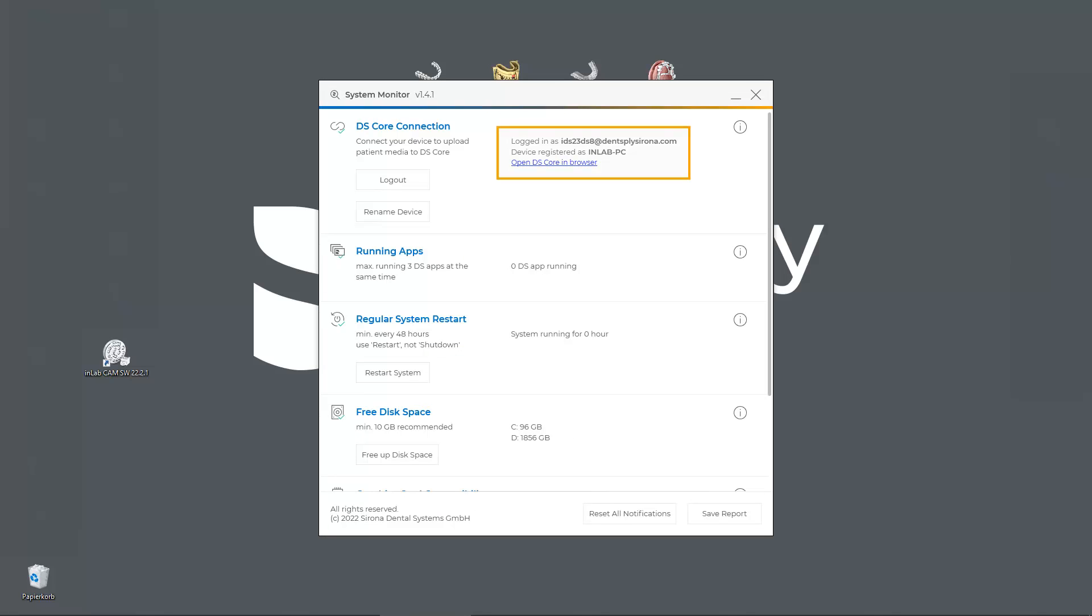Now we get the confirmation that we are logged in. Next we go back to our DSCore account.